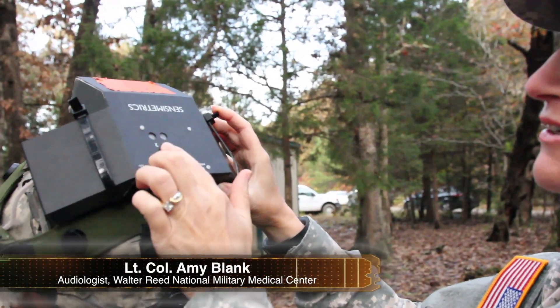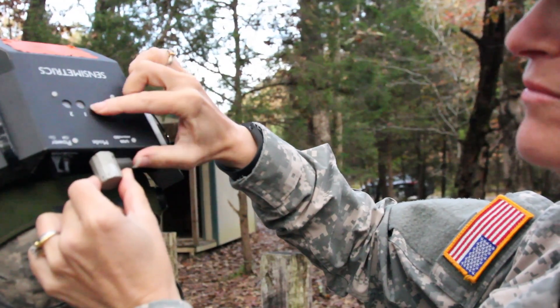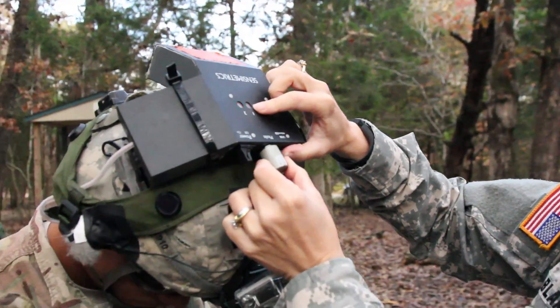See how the lights are coming on? It'll come back on here in a second. You can see it's flashing, and then we can set it to different hearing losses. Essentially when I'm dialing in, it changes color depending on the hearing loss.